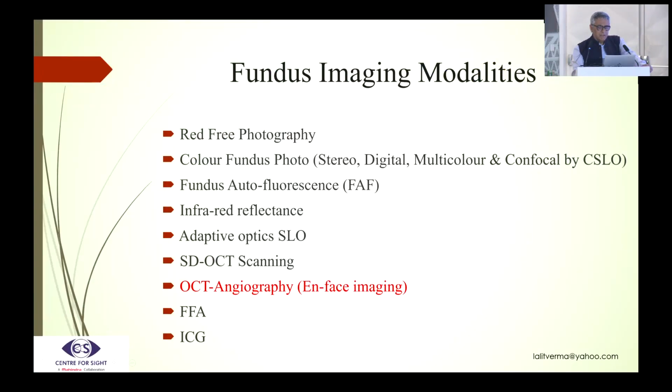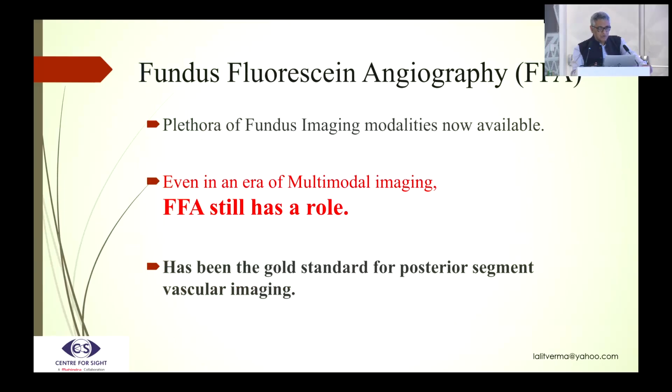Today imaging modalities are so many, and without recourse to these modalities, we sometimes cannot pinpoint the diagnosis. I sometimes get scared thinking about what we were doing when we did not have all these things, a couple of decades back. Today it's the era of multimodal imaging, and I still believe that my FA machine is still alive, not dead. We still use invasive angiography, which has been the gold standard for a long, long time.